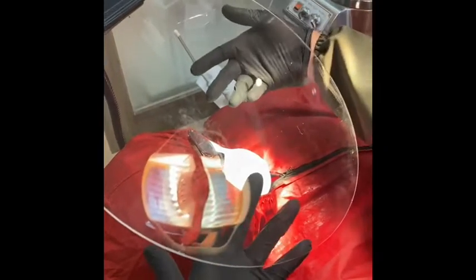Yung assistant mo makakagalaw din, ikaw makakagalaw ka rin. I would highly recommend this. It's a dental shield from Dentacube. Highly recommend it.